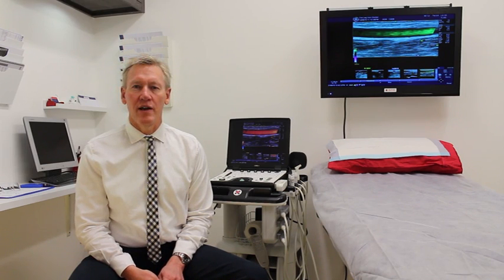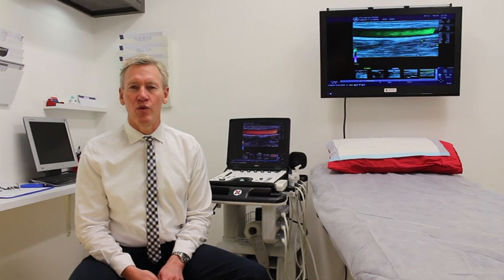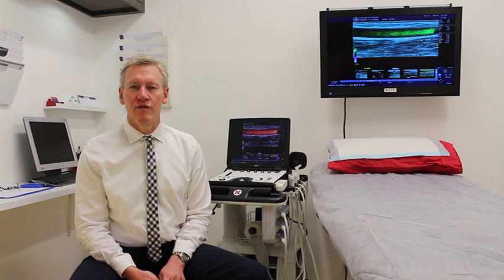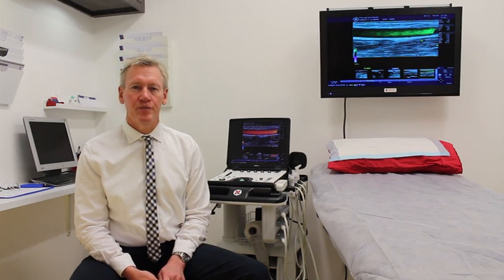If it's larger than that, due to varicose vein disease, the vein will appear perhaps more than 5 mm in diameter. Sometimes these veins can be up to 15 mm in diameter and yet not reveal themselves on the surface of the skin, but they give themselves away by the fact that beneath the knee there are large varicose veins.